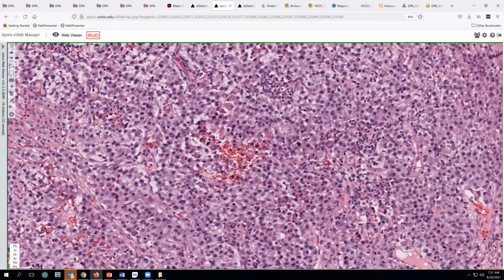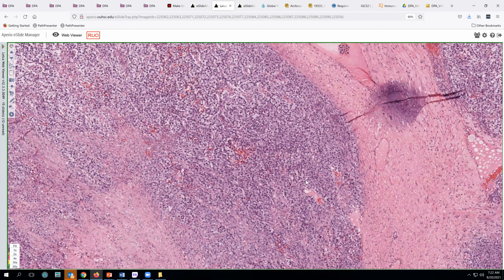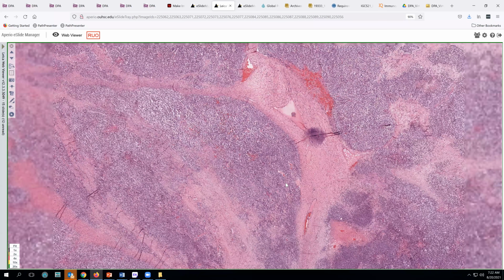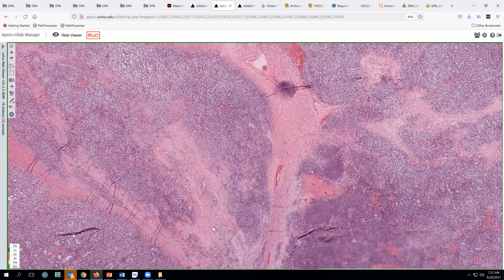There were a few scattered HCG positive cells, but that does not preclude that diagnosis, but does indicate that potentially that might be slightly elevated as a tumor marker in this case. So the final diagnosis on this case is a dysgerminoma. It was localized to the ovary, so it's a stage one case. There was a little bit of roughening of the surface, so I think it was a 1C because of possible partial rupture.